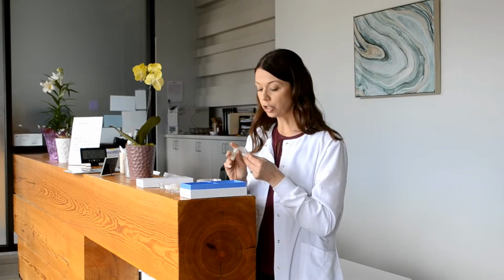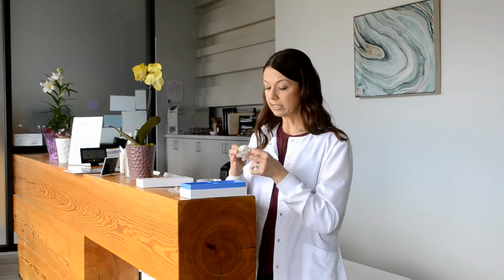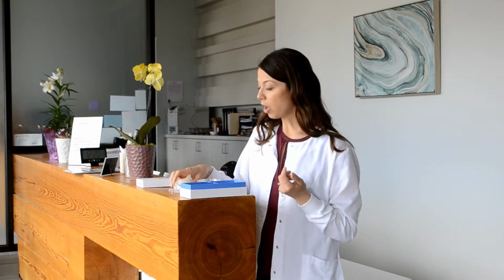We have an option to go all the way up to 3 millimeters. So basically, the addition of the top number and the bottom number equals the advancement in millimeters. So for example, if you look from the side, this is 1 millimeter. The jaw is just jutted a little bit forward 1 millimeter. Then we can go to U2 and L0. 2 plus 0 is 2. And so that's 2 millimeters. And then the next step would be U2 and L1, 2 plus 1 is 3, and that would be 3 millimeters. I can say in all honesty, I have no one at 3 millimeters.